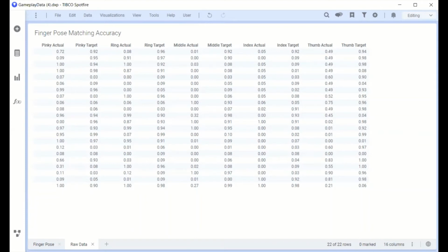So what we have displayed here is our raw data table uploaded directly from our gameplay. The data table includes the actual pose alongside the target pose for each finger. A simple percent difference calculation was made to see just how well the player did. Once we made that calculation, we used Spotfire's visual representation tool to create a box plot as shown.